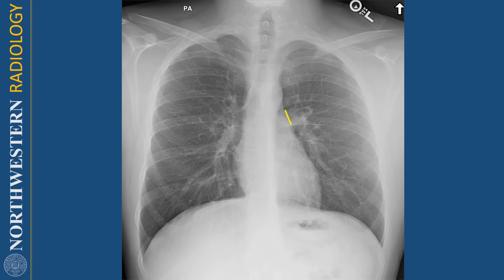Just below the aortic arch is the pulmonary artery — this is the pulmonary artery contour, a sort of straight line just next to the left hilum. If this is the pulmonary artery and this is the aortic arch, then that little divot here is the aortopulmonary window, or AP window for short. It should normally be a little concave divot in the contour of the mediastinum. If you start to see it bulging out, that can be a sign of enlarged lymph nodes.